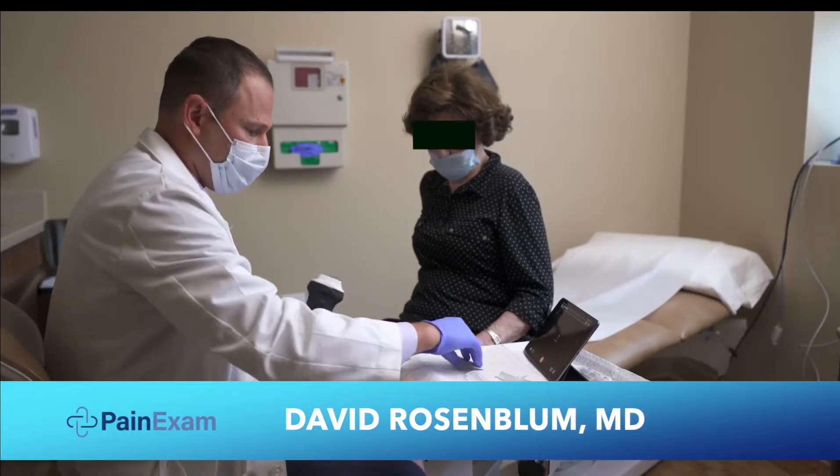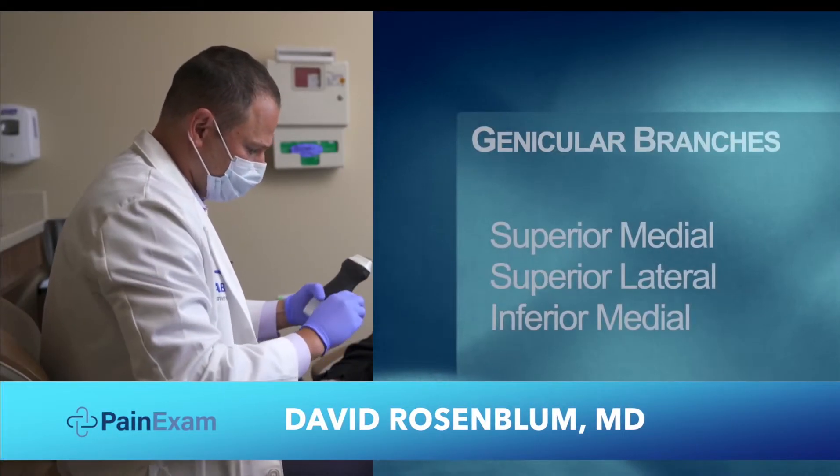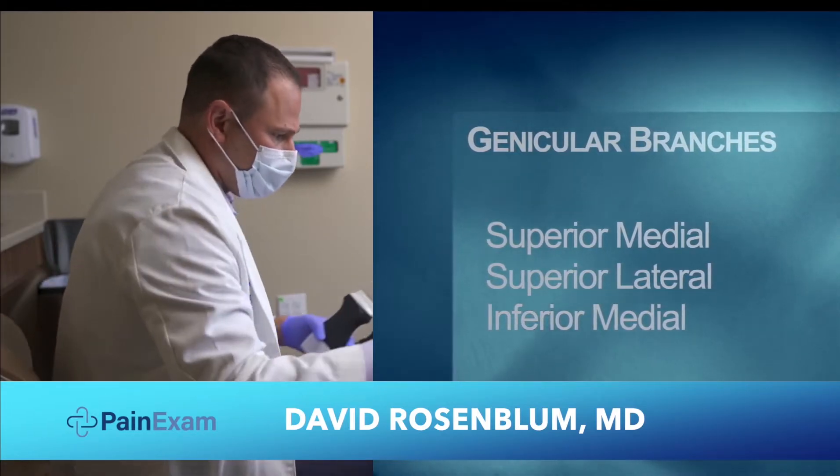We're going to do a genicular nerve block. There are three branches: the superior medial, superior lateral, and inferior medial branch.